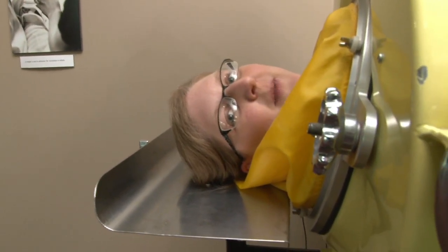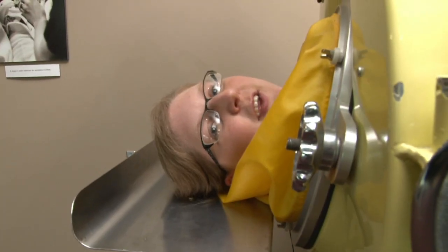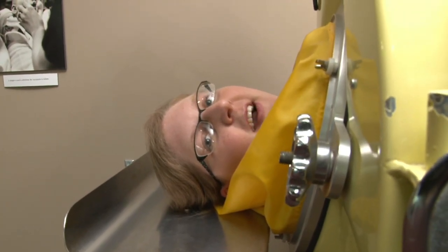Hi, I'm Cassie Nesper from the Rose Malnick Medical Museum at Youngstown State University. Today we're taking an in-depth look at the iron lung.